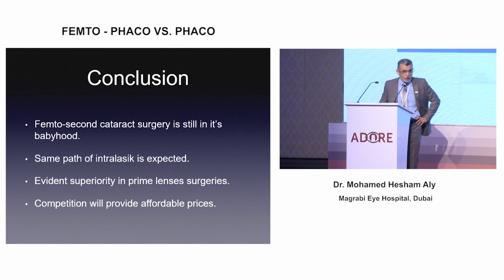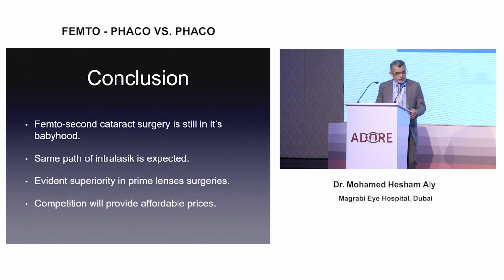doctors working with you. So in conclusion, the femtosecond laser is still in its babyhood, and the same path was followed by intraLASIK when it was introduced first. It has evidence of superiority, especially if you're using premium IOLs, and competition between the machines will always provide us with better technology. Thank you very much for your attention.